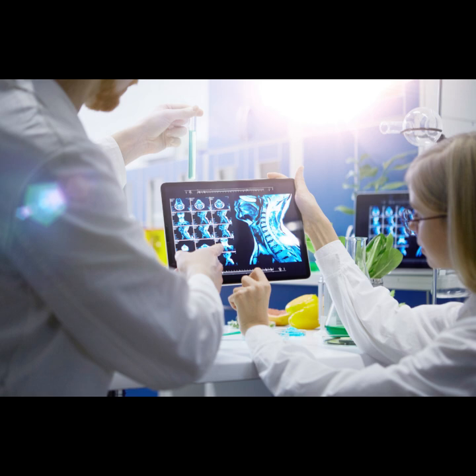The downside? Always a downside. The sampling density is very high at the center but gets sparse further out. This can lead to some blurring or streaking artifacts, especially at the edges, and requires more complex reconstruction algorithms than simple FFT. Resolution might not be quite as good as Cartesian in a perfectly still patient.